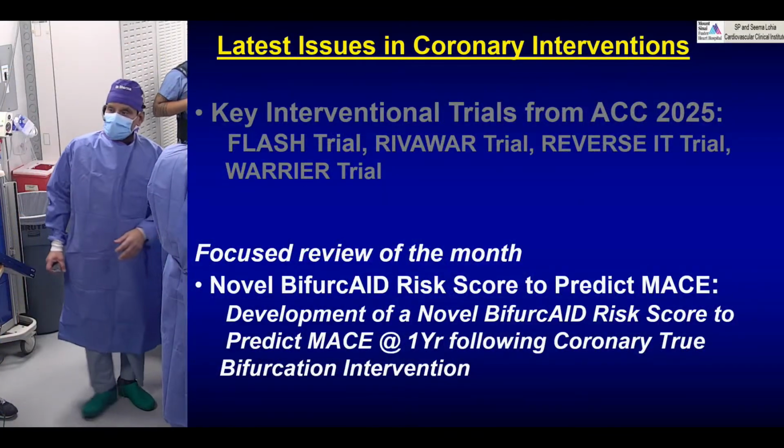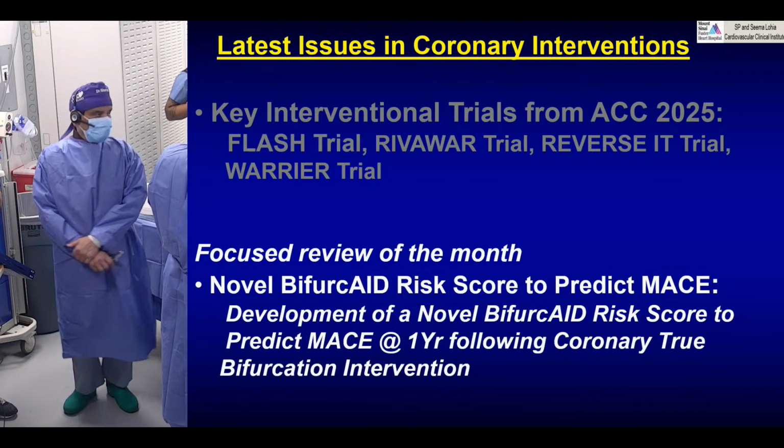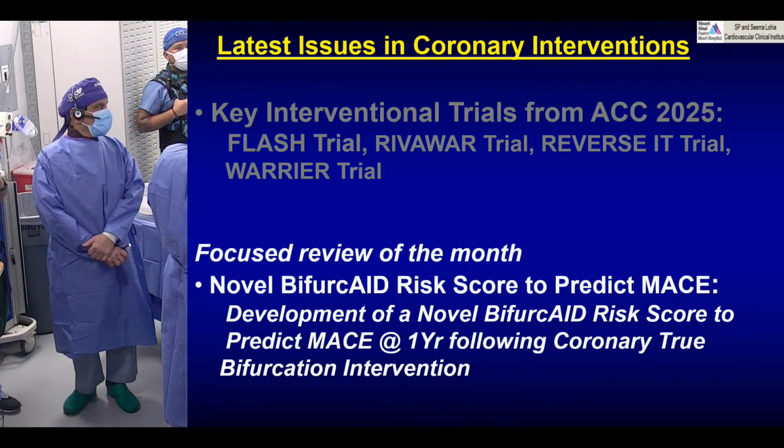Yeah. No, let's ask Kiski. You happy? Yeah, of course, because MSA is 8.0, much more than 5.5. And the stent is well apposed, though there is a lot of plaque behind the stent.